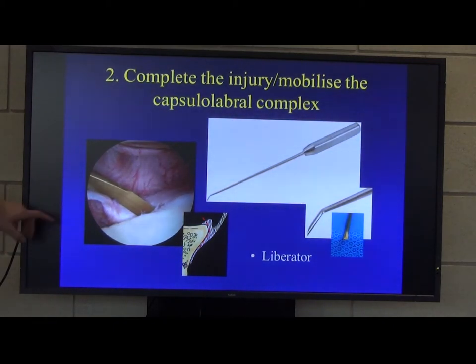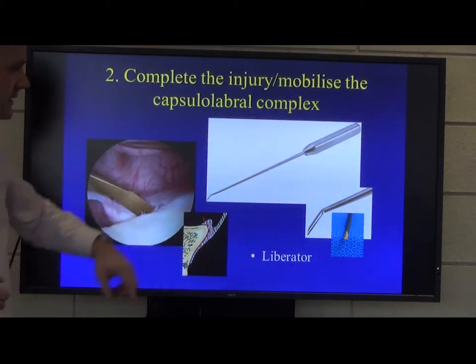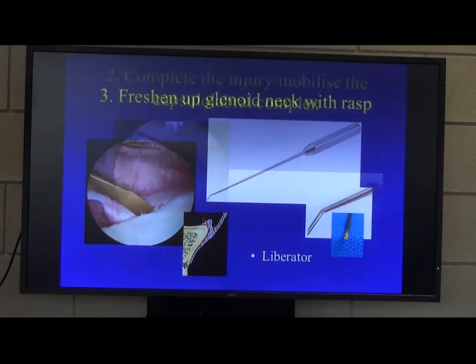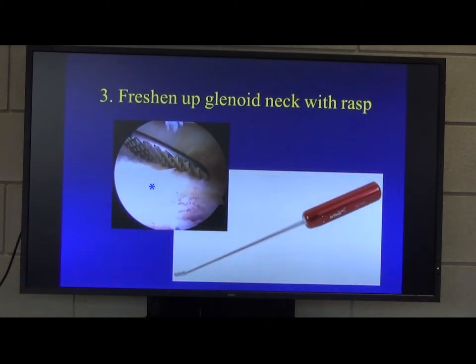For this, we use a device called the Liberator, which is essentially a little blade on the end of a handle. You then freshen up the glenoid neck with a rasp and create a nice bleeding surface with good healing bone.